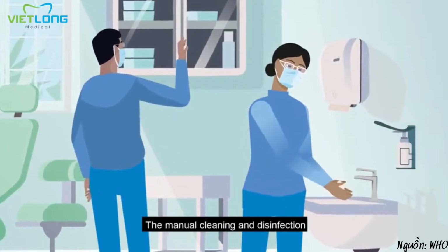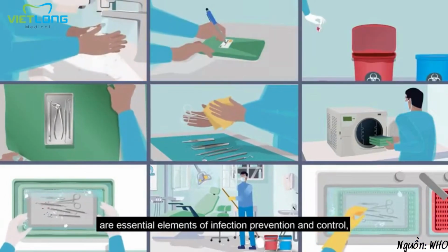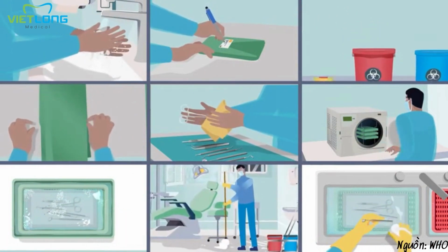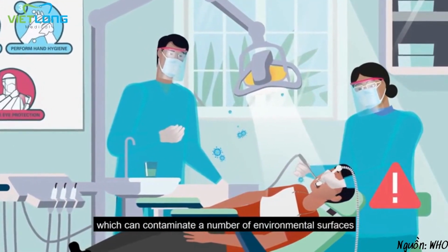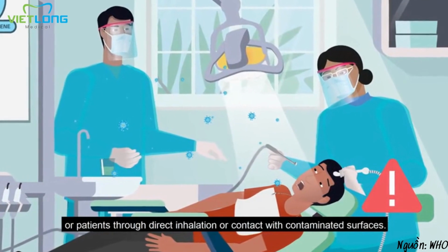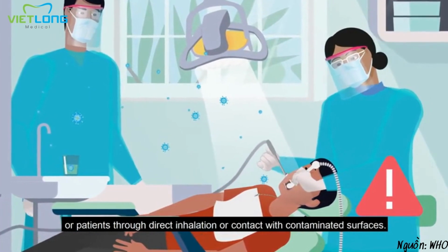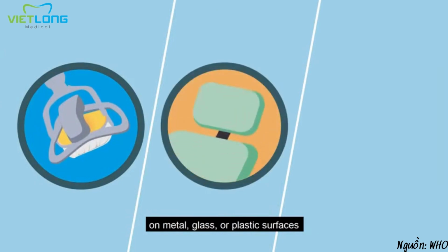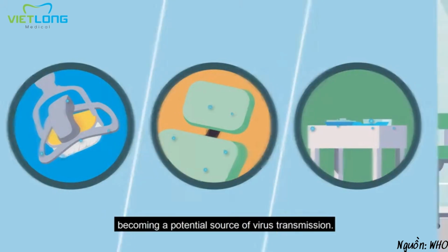Manual cleaning and disinfection of environmental surfaces in oral health services are essential elements of infection prevention and control, especially during the COVID-19 pandemic. Certain medical procedures produce aerosols, which can contaminate a number of environmental surfaces and increase the risk of virus transmission to dental providers or patients through direct inhalation or contact with contaminated surfaces. Studies have shown that COVID-19 can persist on metal, glass, or plastic surfaces for a number of hours, becoming a potential source of virus transmission.